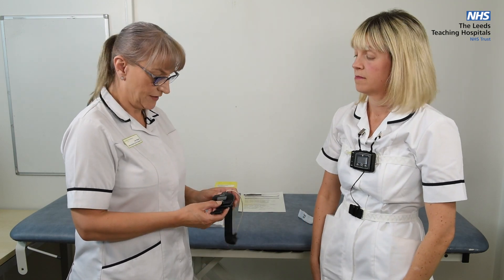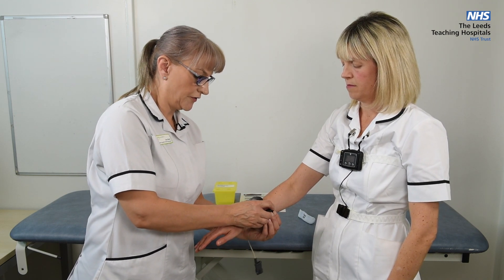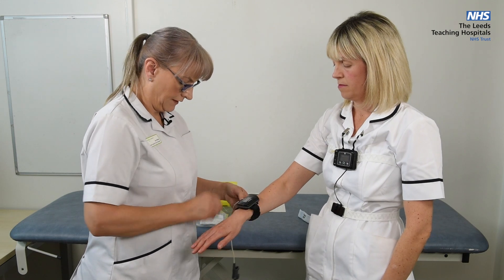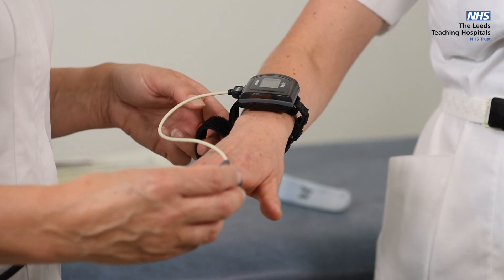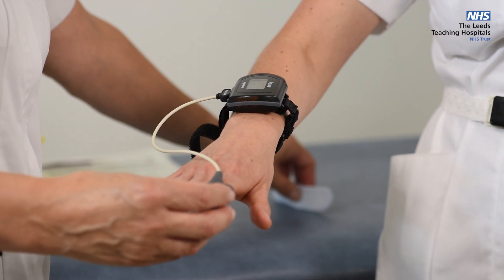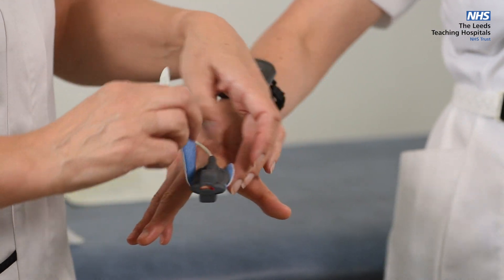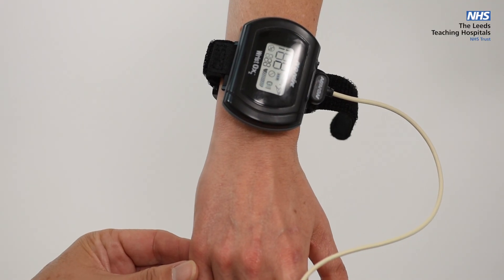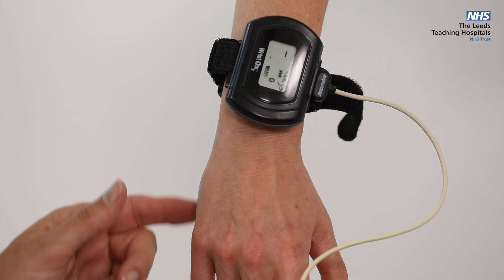This is the pulse oximeter. This goes onto the wrist — secure it using the strap. Place the probe onto the finger, but make sure you have no nail varnish or acrylic nails, with the wire across the back of the finger. Using the posy, secure the wire around the finger. The device will automatically switch on when in contact with the finger and the display will switch on.